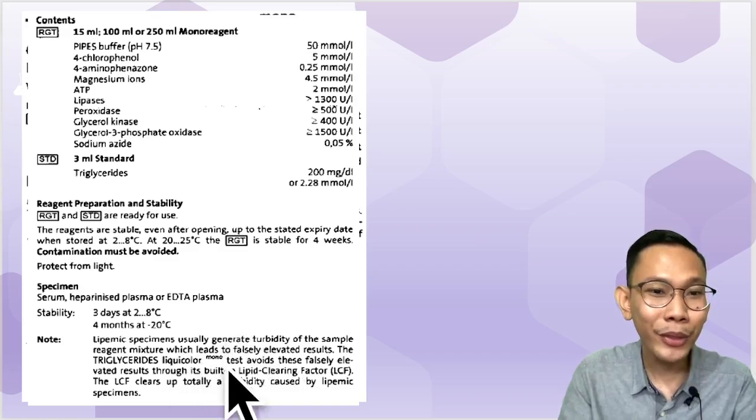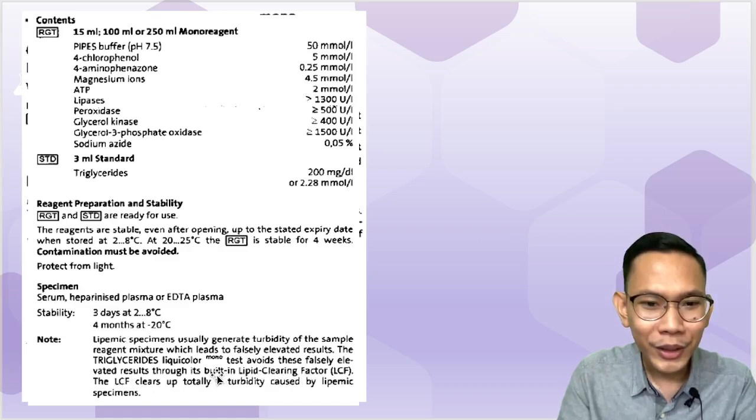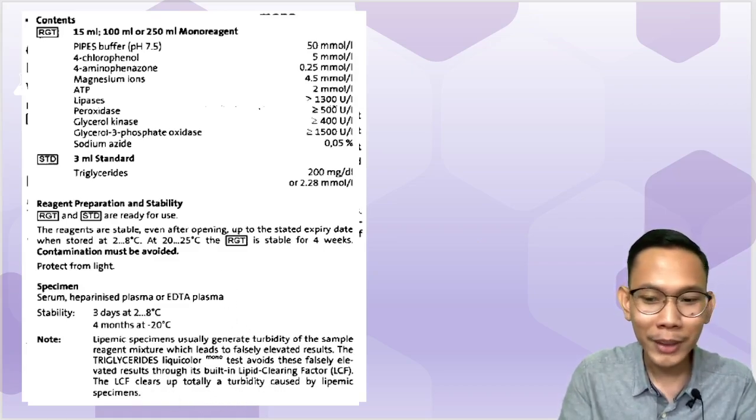Again, our brand is promoting itself once more. The test, Monotest, avoids this false elevated result through its built-in lipid clearing factor. The LCF totally clears up the turbidity caused by lipemic specimens. Wow, promoting again.